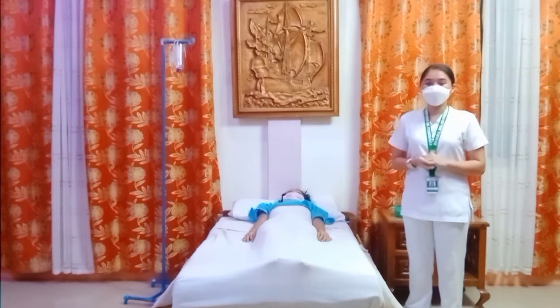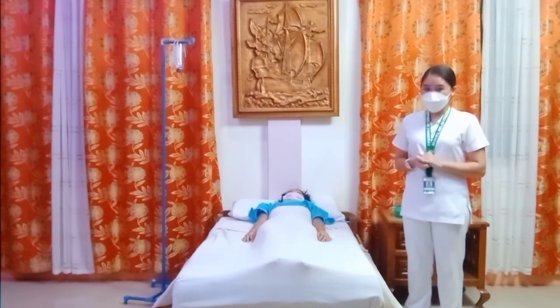Next is to explain what you are going to do and why it is necessary.